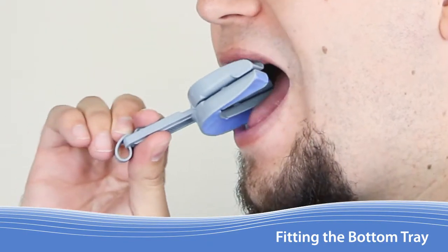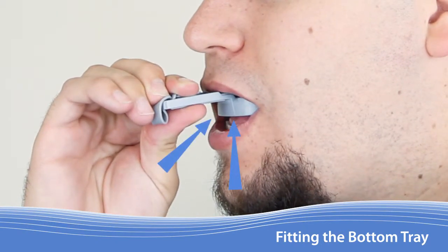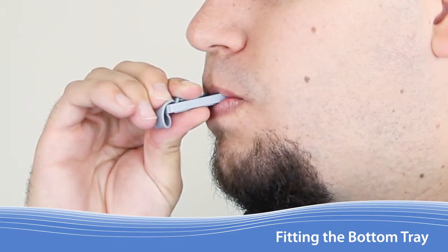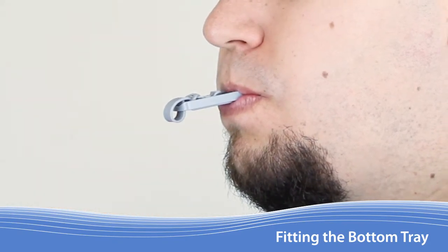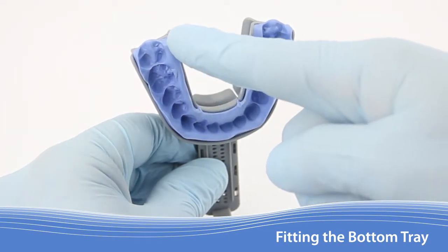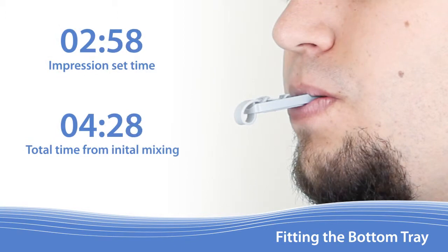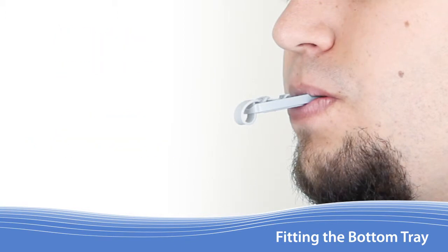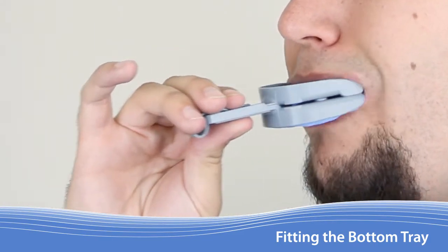Now instruct the patient to insert the Apnea Guard by first pressing the front of the upper tray against the front of the upper teeth, then centering the handle, and finally biting firmly into the lower tray until both upper and lower teeth are making full contact with the respective trays. Instruct the patient to use their tongue to smooth the retention material along the inner walls of the lower tray. It takes 3 minutes after the 1 and a half minutes of working time for the retention material to fully set. Ask the patient to remove the Apnea Guard and offer them a tissue to wipe away saliva.